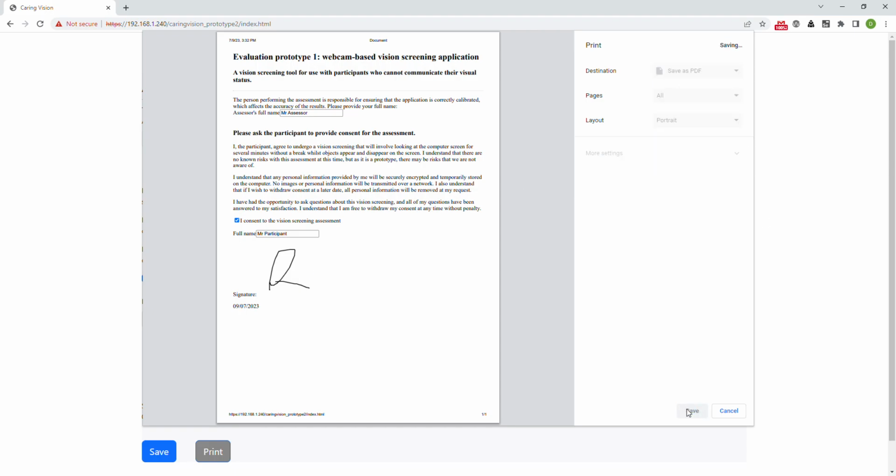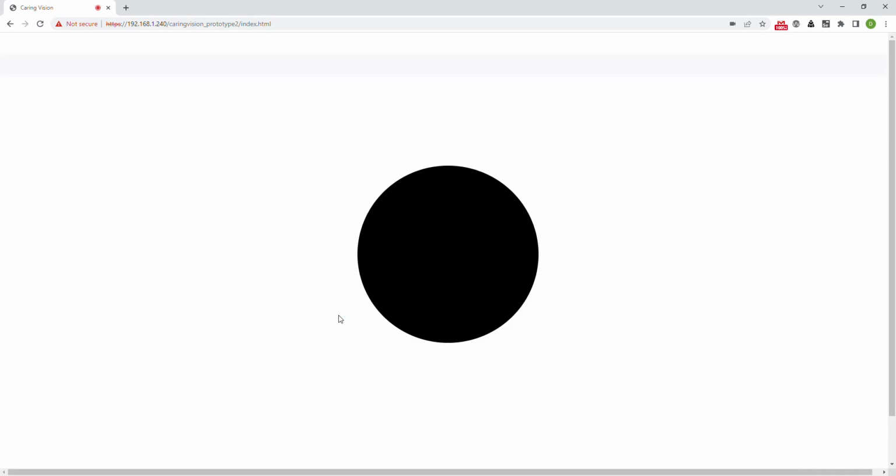In this case, I'm going to do that. I'm just going to put it on my system and save it as a PDF. Save. There we go. And now the assessment starts, and the first thing you'll notice is a great big black spot in the middle of the screen, which of course your eyes are naturally drawn towards.